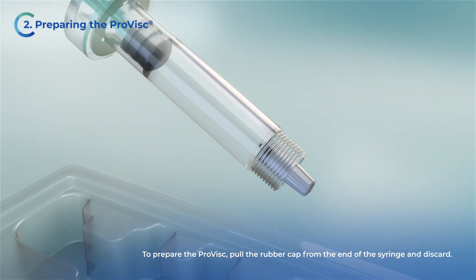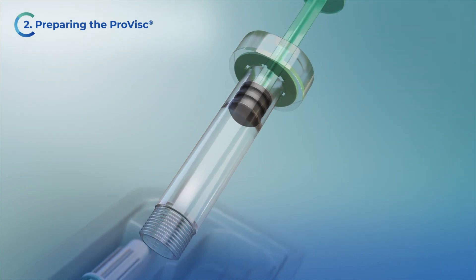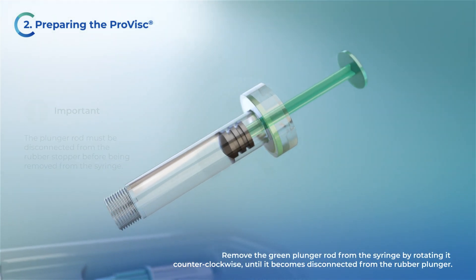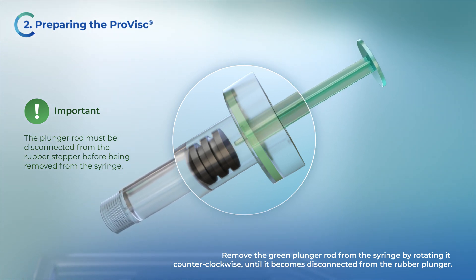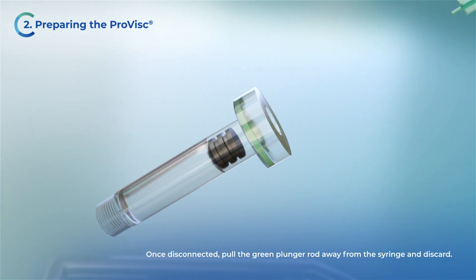To prepare the ProVisc, pull the rubber cap from the end of the syringe and discard. Remove the green plunger rod from the syringe by rotating it counterclockwise until it becomes disconnected from the rubber plunger. Once disconnected, pull the green plunger rod away from the syringe and discard.